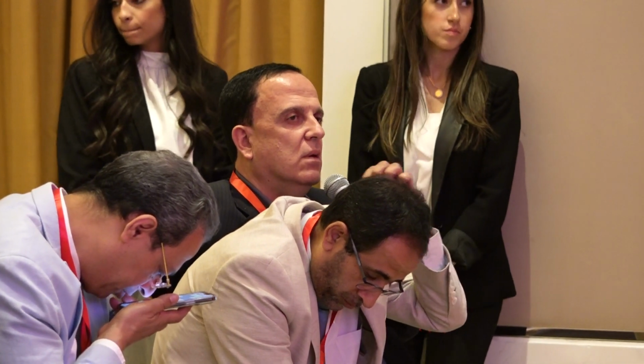The second thing, when you want to make a communication, it is better to be 100% sure that the communication is far beyond the ostium, in order not to compromise the circ, or to go into the subintima, or into the aortic wall. So I was not sure how you punctured that cap, and how you made the connection between the retrograde wire and the antegrade wire.